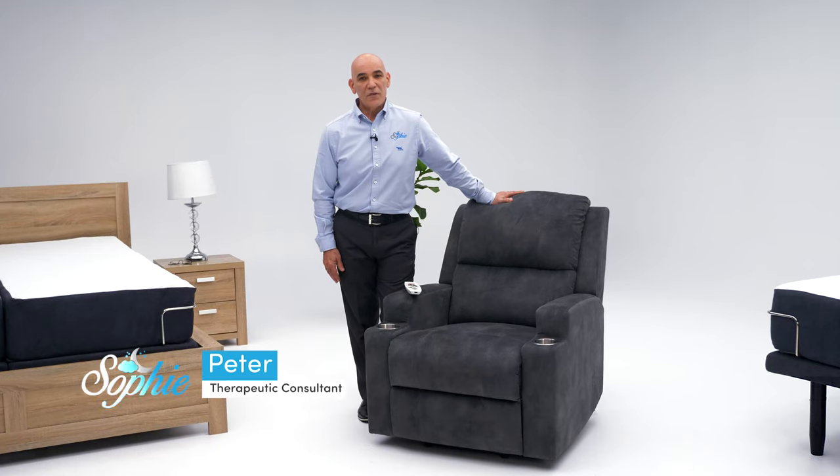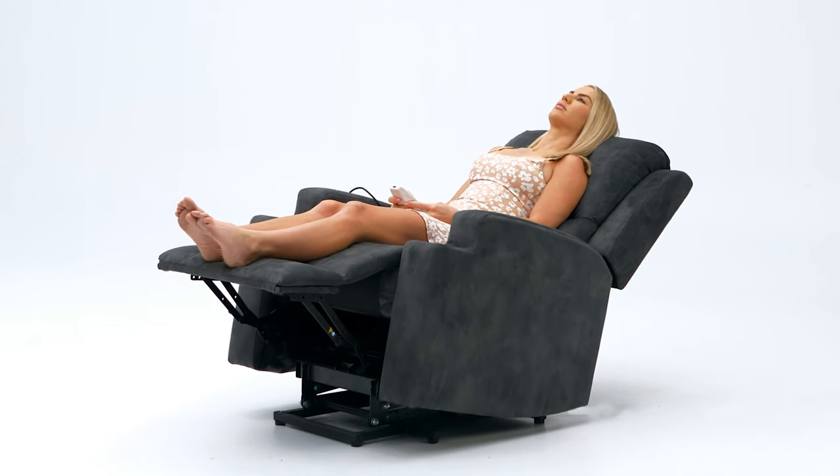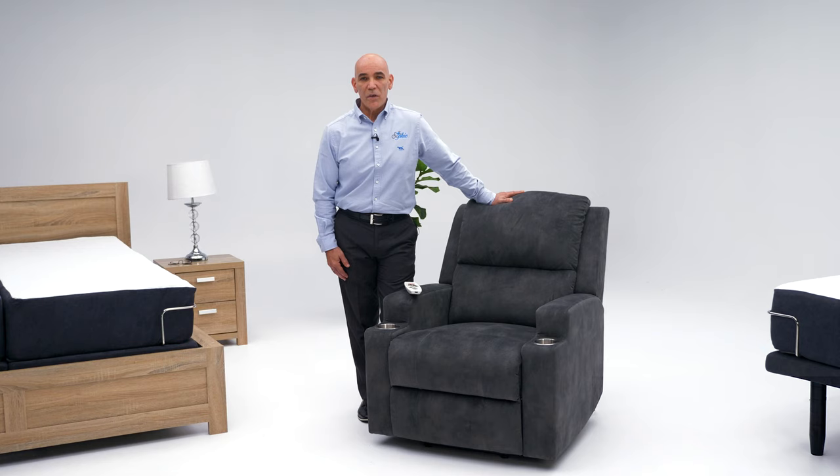Hi there, I'm Peter from SleepSophie. It's my pleasure to introduce you to the Sophie Luxury Therapeutic Lift Recliner Chair. The chair is orthopaedically designed to pick you from the right points and support your entire body.